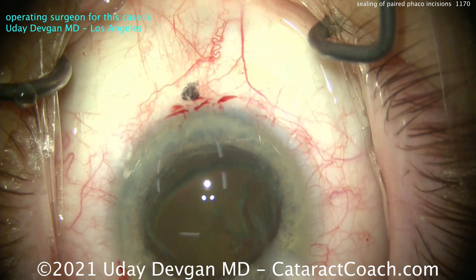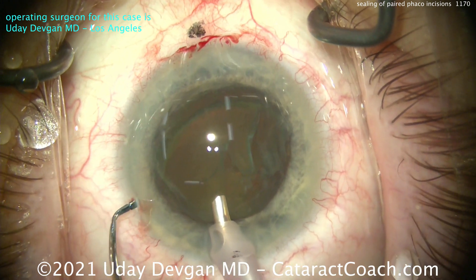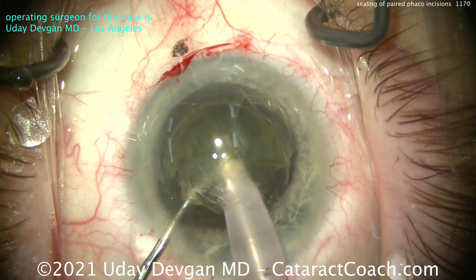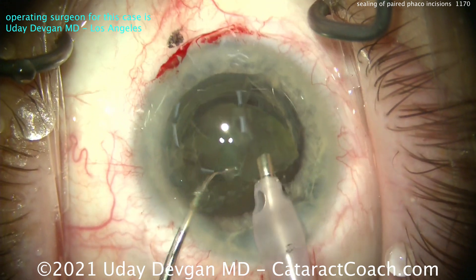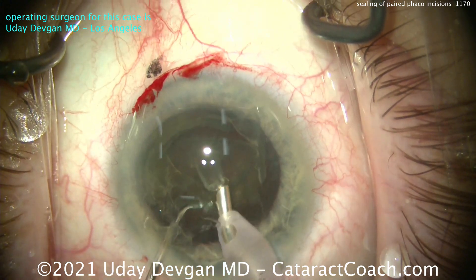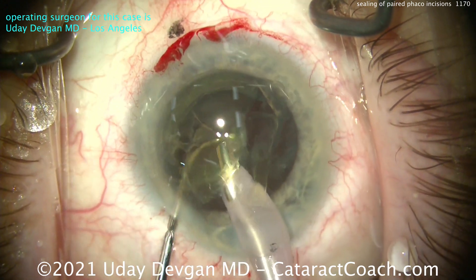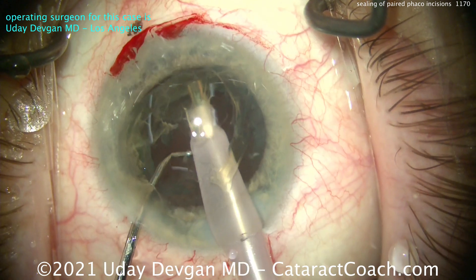I'm going to show you something here. We're going to do phaco with an infusion pressure of 95 millimeters of mercury — yes, that high. That's like a bottle height of 120, 130. As I chop this nucleus and break it into pieces, the pressure in the eye is 90-plus millimeters of mercury — very high compared to a normalized 15, 18, or 20. Look at the blood there at the top of your screen. It's still there. If that incision was leaking, you'd see that blood being washed away — but it's not.